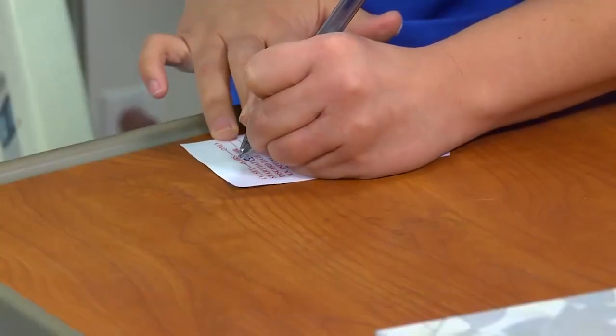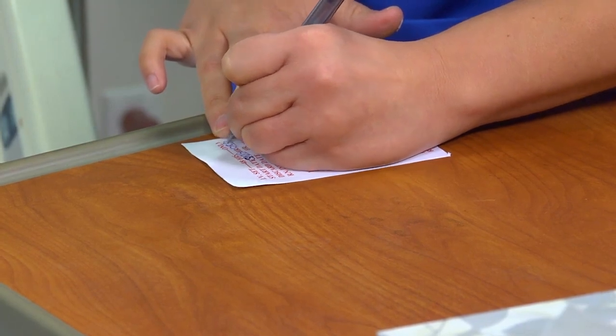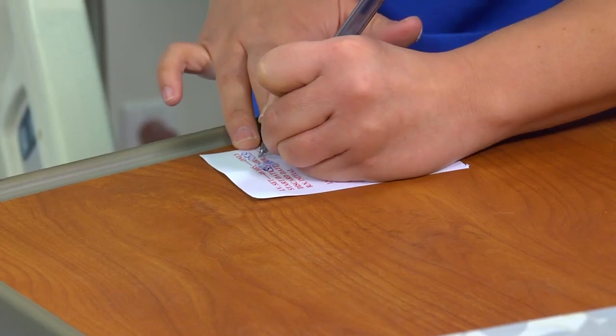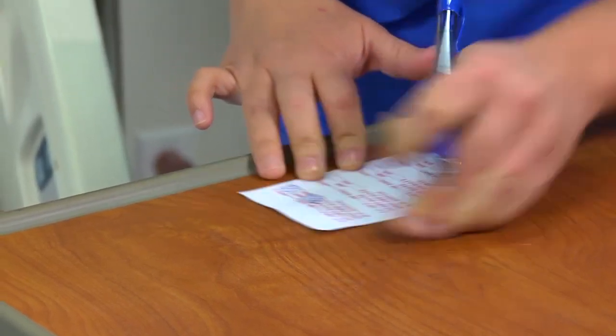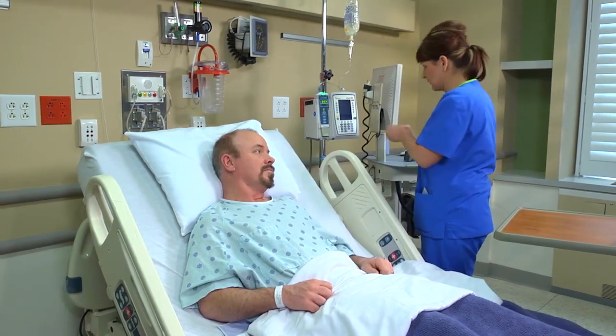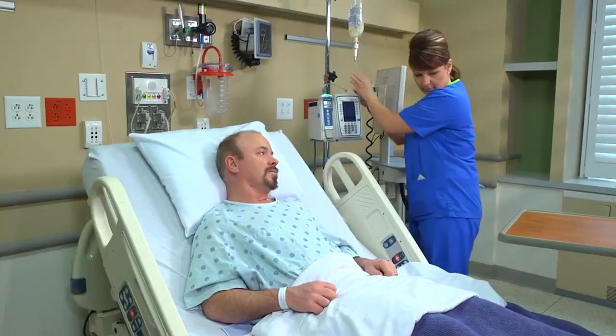Label the tubing with the date, time, and your initials according to your agency's policy. If not completed by the pharmacy, label each IV bag, including the type of fluid and any additives it contains, the patient's name, and the date and start time of the infusion. Initial the label if required by the healthcare agency.